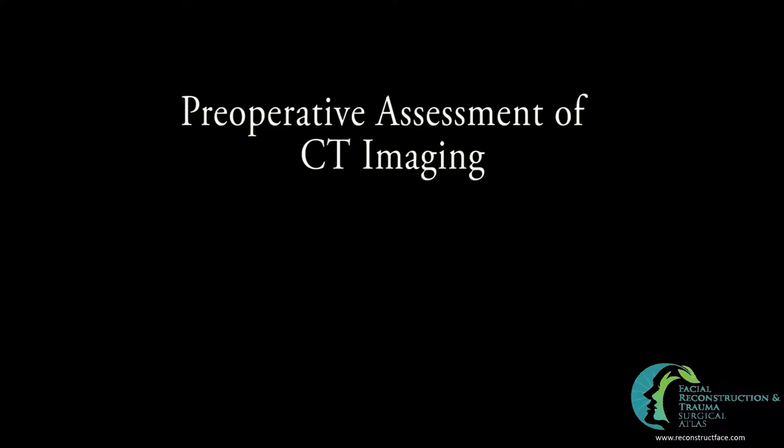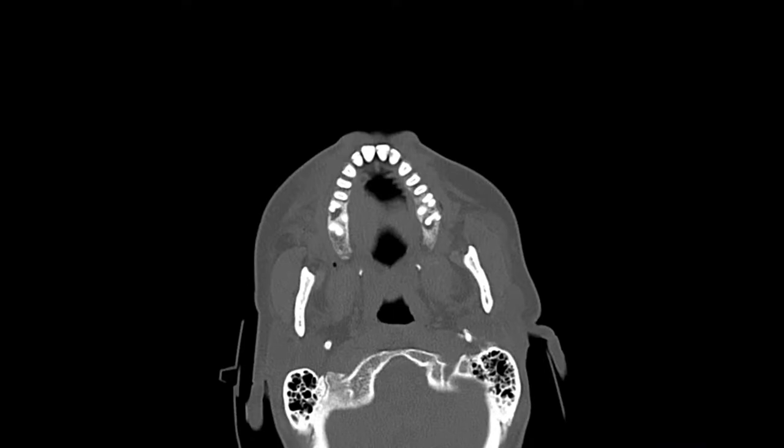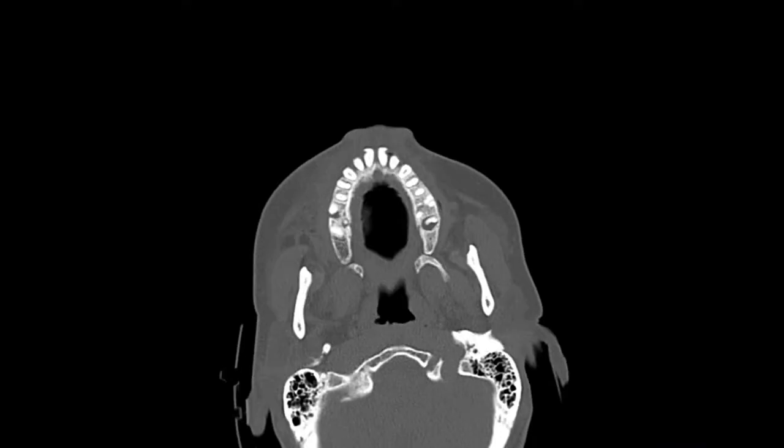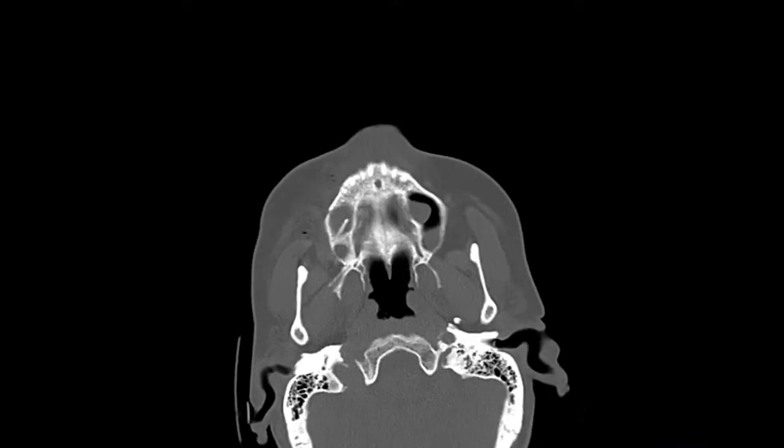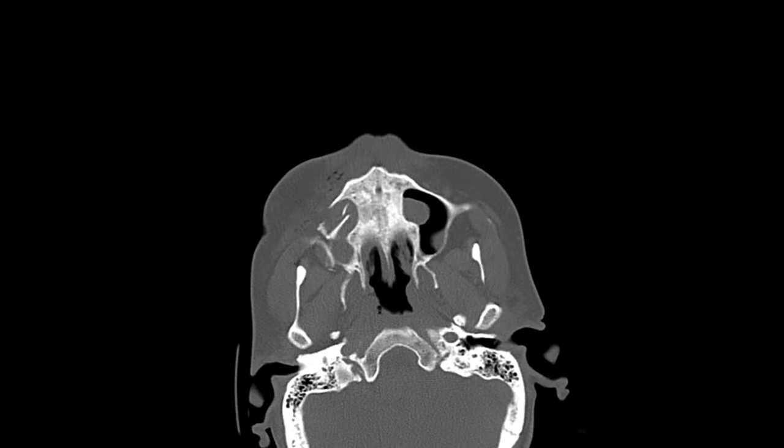In this section, we'll scroll through preoperative CT scans and I'd like for you to identify fractures on your own before we review them together.